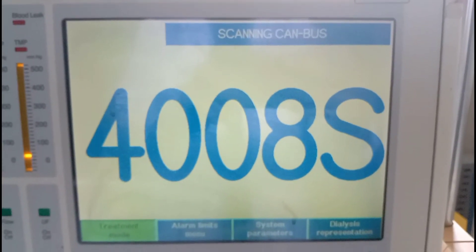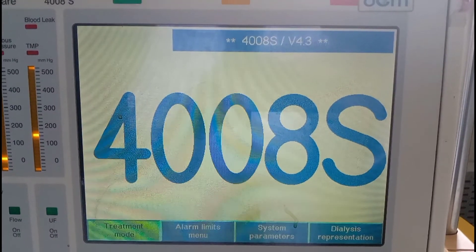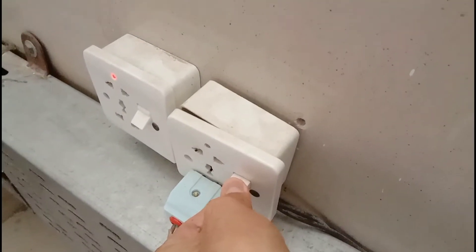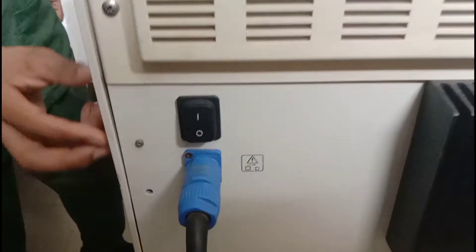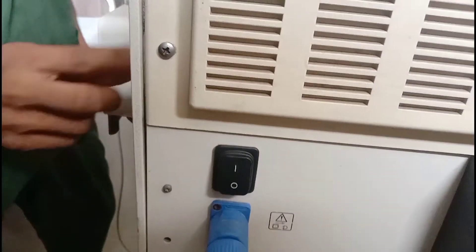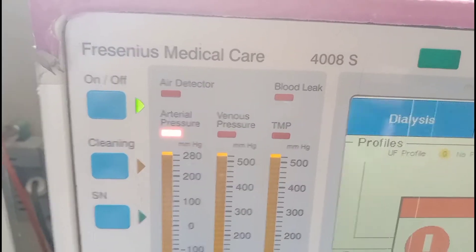In this video I'll teach you about all parts of a Fresenius hemodialysis machine, that is the 4008S model. First of all, here is the main power supply switch, and after this there is a rear switch that is behind the machine. On the front side of the machine there is also an on and off button that is shown on the screen.